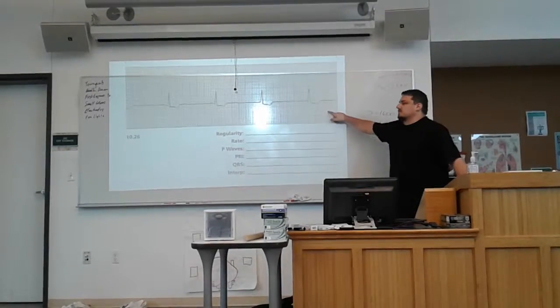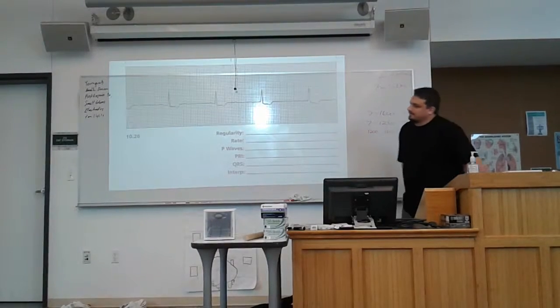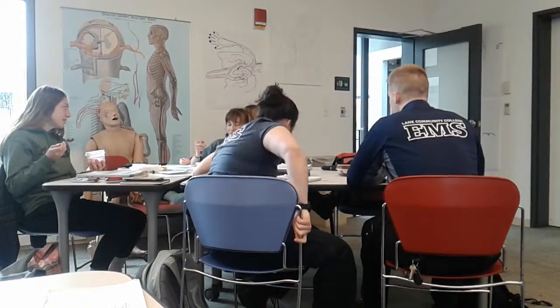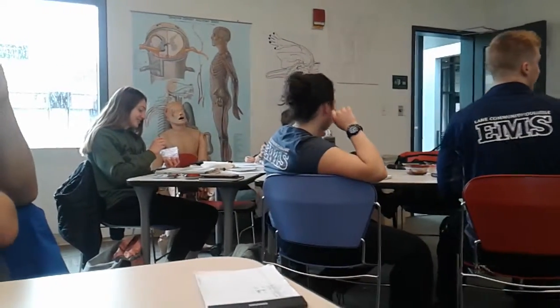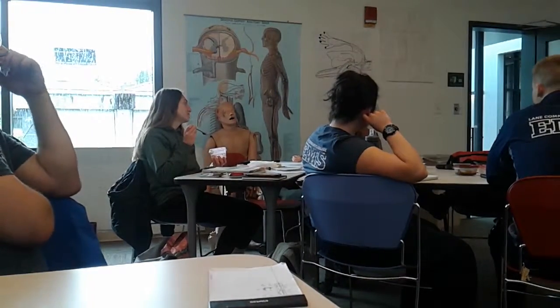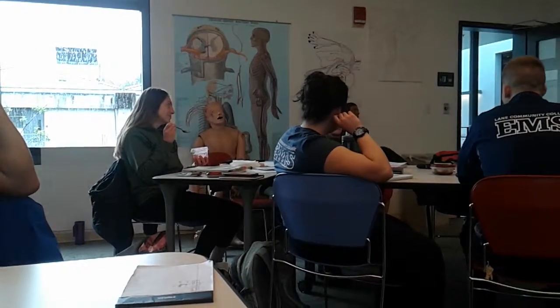So Annalise, do you think this is a type 2? Yeah. Can you explain why? Because if you look at it, the P's march. That's a good place to start. Excellent. Continue on. Maddie. I don't know, I do a lot of my work based on vibes.